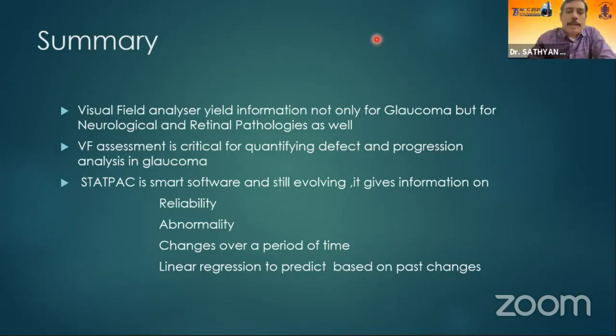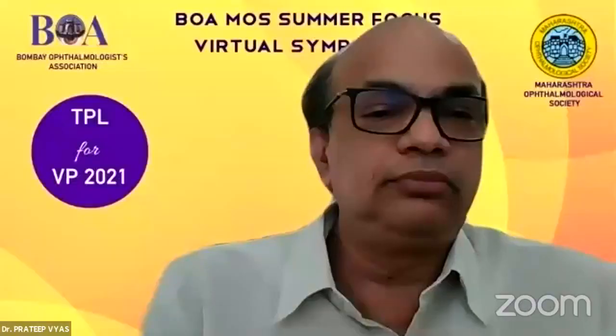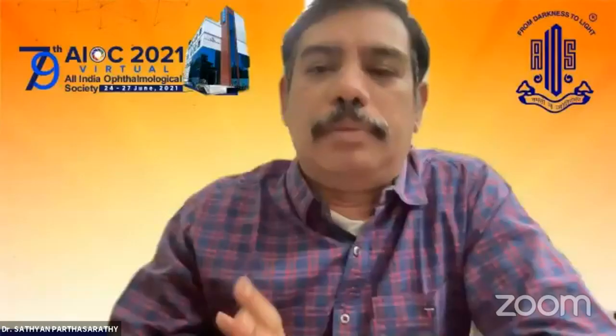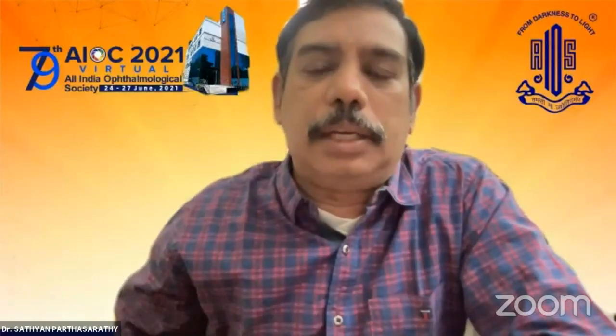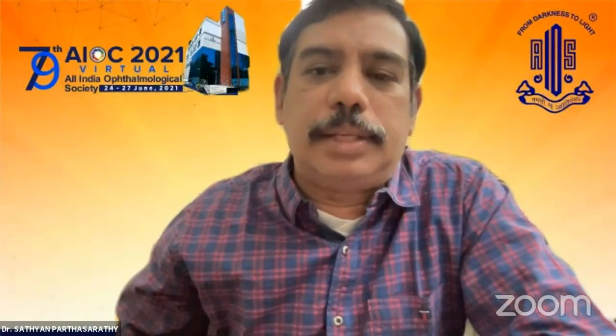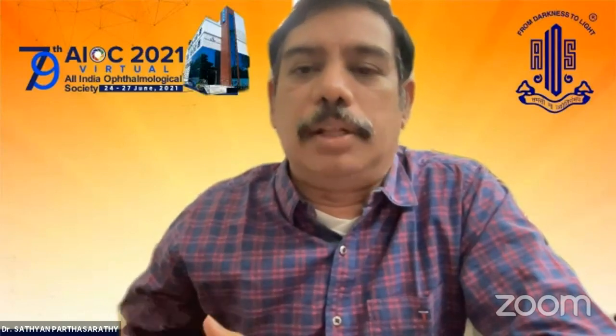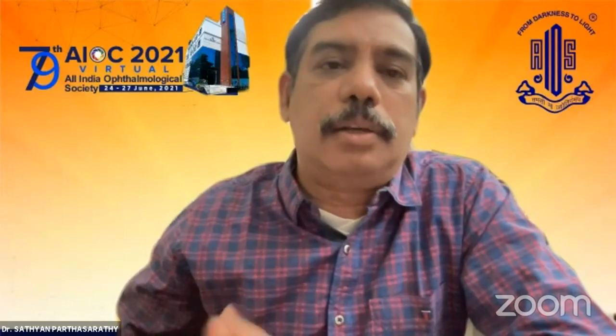Prateep, for an excellent talk on what information you can get from the Humphrey fields. It is just not enough to look at one field and say, okay, you have all the data. There is so much that the machine can give you. So try to understand all the points, so that when you are doing your practice, you can understand what other things you can look at to assess the progress.